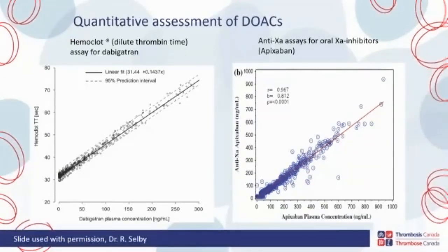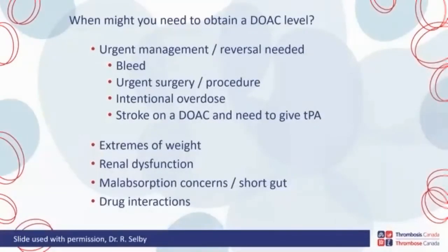So you can see recovery is excellent. And these calibrators are HPLC calibrated. So they are a drug level because they are giving us a concentration of nanograms per ml. So as I said, monitoring the DOACs is not recommended.